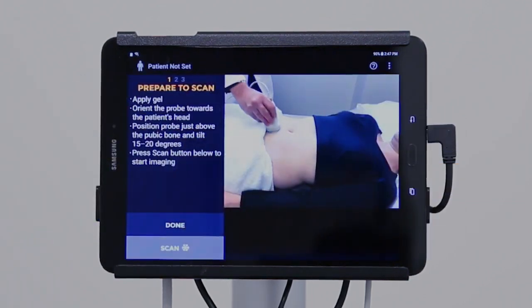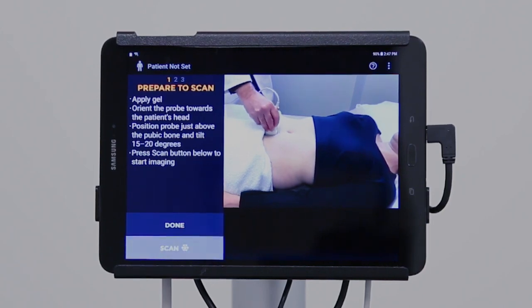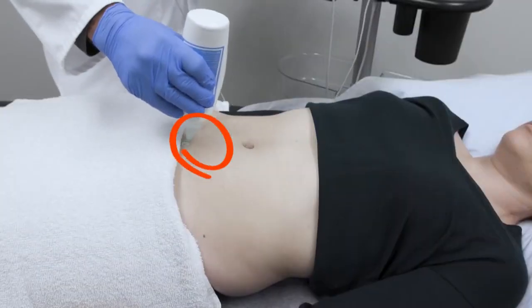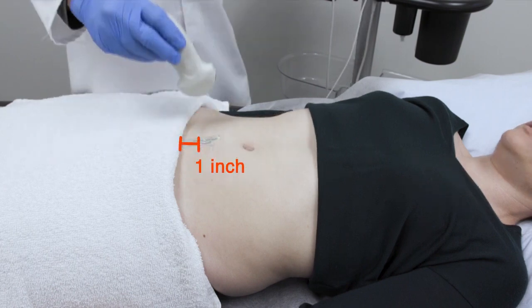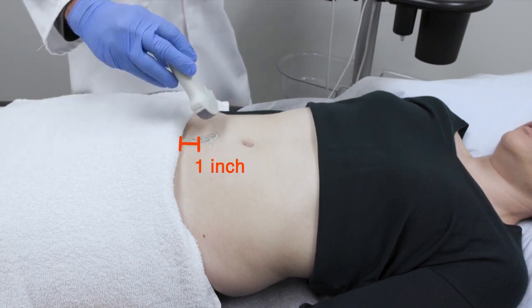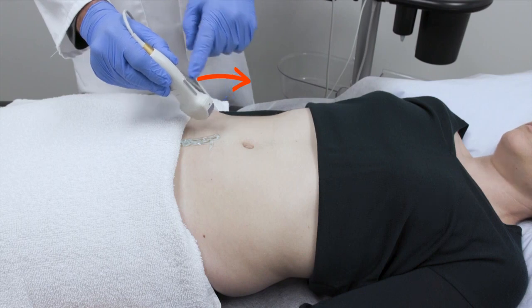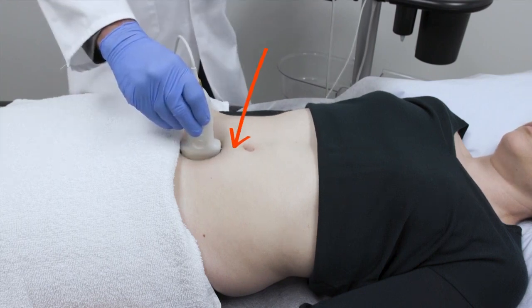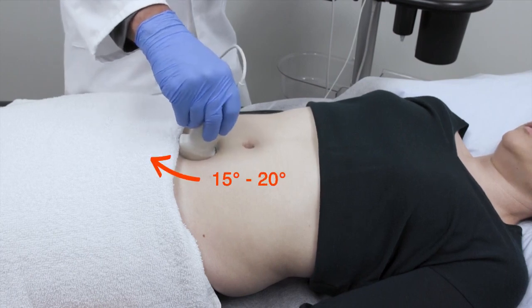Lay the patient as flat as can be tolerated. If necessary, palpate the patient's pubic bone. Apply the gel and position the probe about an inch above the pubic bone with the orientation marker facing towards the patient's head. Apply pressure firmly. Tilt the portion of the probe in contact with the patient 15 to 20 degrees towards the feet.